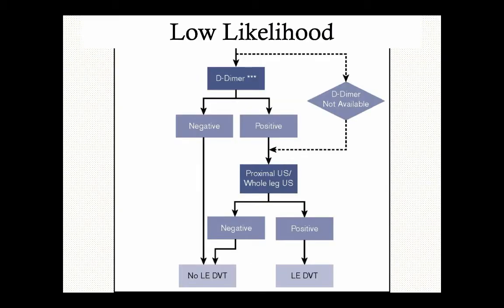And for those of us that may not be as comfortable, if you do get that positive ultrasound in formal radiology, it's just like when somebody sees something on a CAT scan that you don't see, you go back and try to find it. To me, I think there's probably a lot of opportunity for the residents and ourselves to go, oh, there's a DVT there. Let's go find it and take that time to learn what a positive looks like, if either you missed it the first time around, or you just need to. That's how I taught myself most of ultrasound, was going back and chasing an ambulance to positive studies on CAT scanning or whatever.